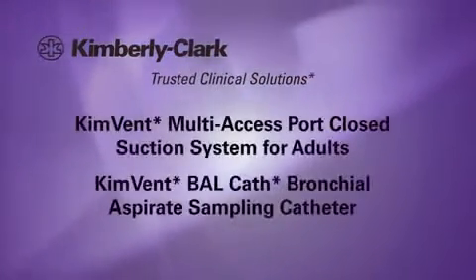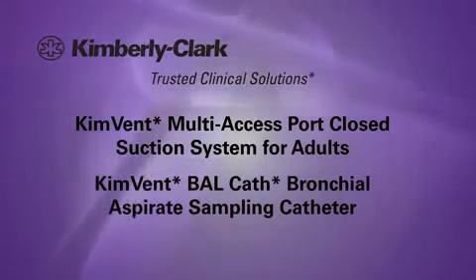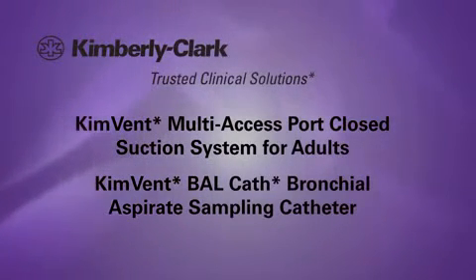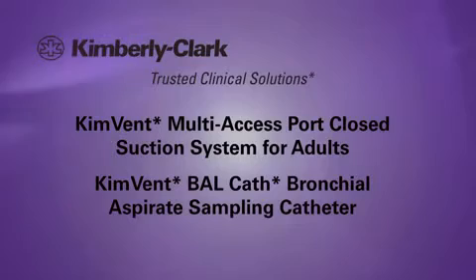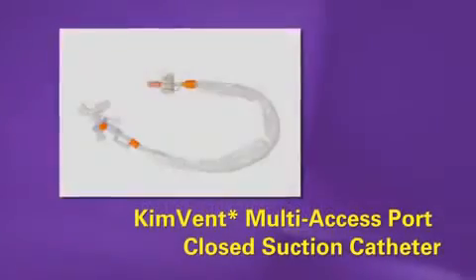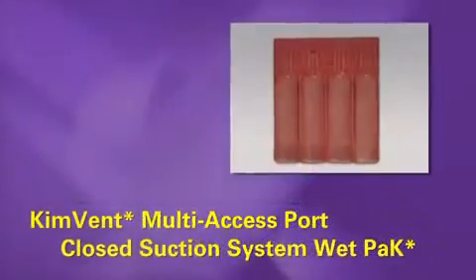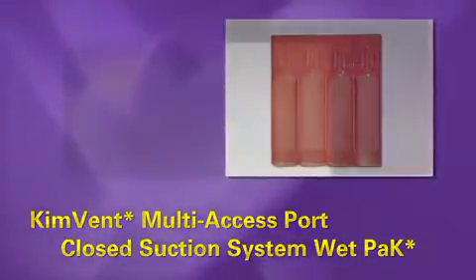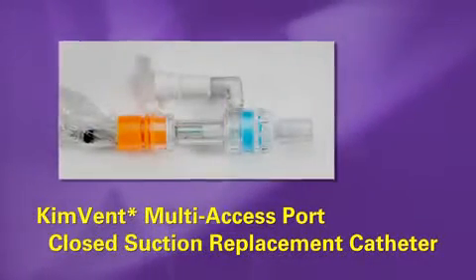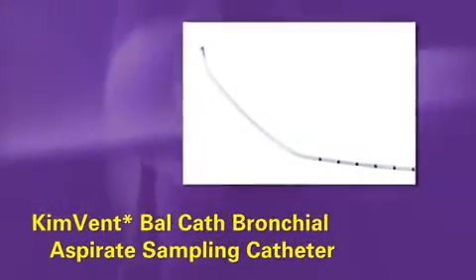Welcome to our demonstration of the Kimberly-Clark KimVent Multi-Access Port Closed Suction System and the KimVent Balcath Bronchial Aspirate Sampling Catheter. The demonstration you are about to see applies to the following family of products: KimVent Multi-Access Port Closed Suction Catheter, KimVent Multi-Access Port Closed Suction System Wet Pack, KimVent Multi-Access Port Closed Suction Replacement Catheter, and the KimVent Balcath Bronchial Aspirate Sampling Catheter.